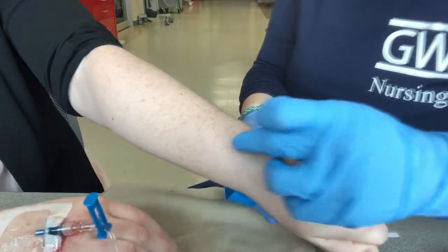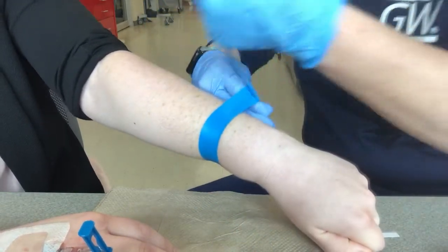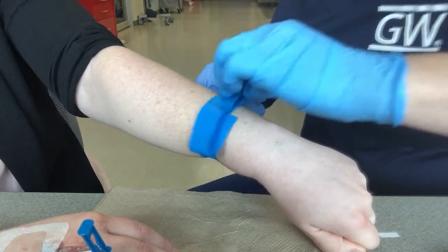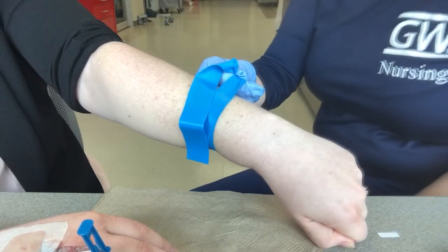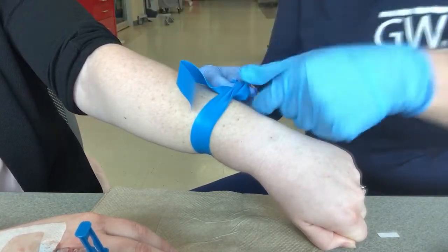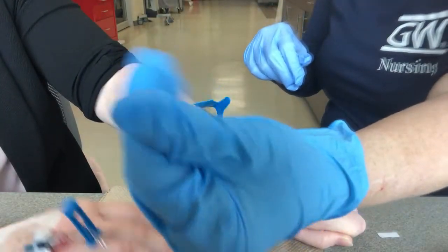I've kind of already identified my site — there's a spot right here. Now, get gloves that fit. This is one of those times: most of the time I don't mind what size gloves I wear, unless I am doing an IV or drawing blood, and then you need to have gloves that fit.